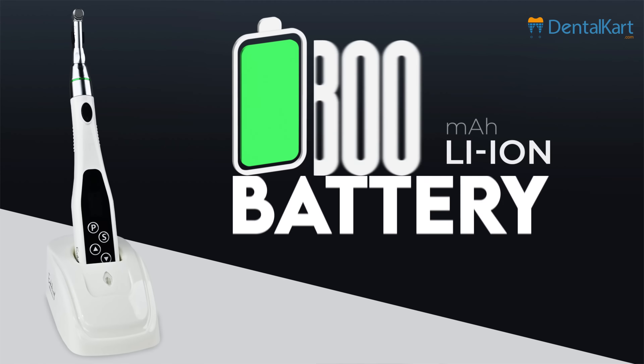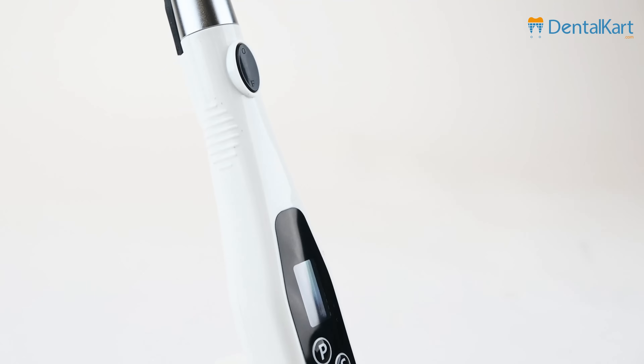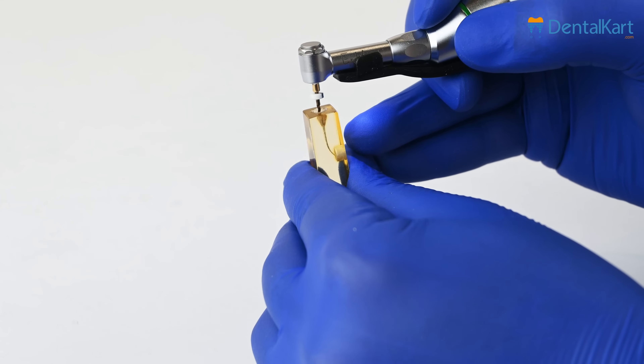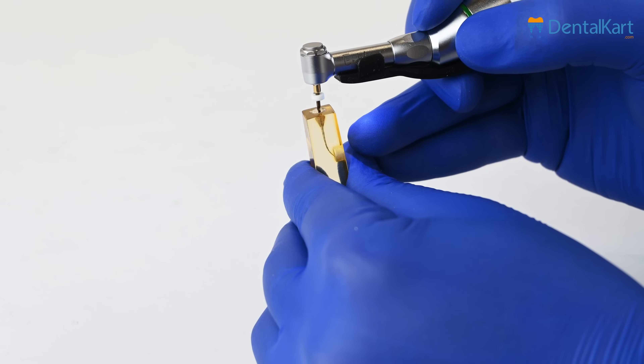With an 800 mAh lithium-ion battery, this endomotor delivers reliable performance throughout extended procedures, minimizing downtime and maximizing productivity.